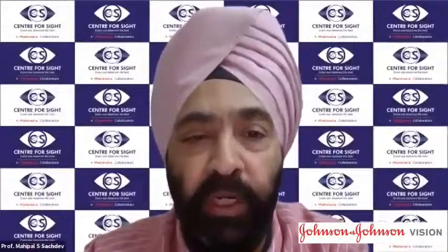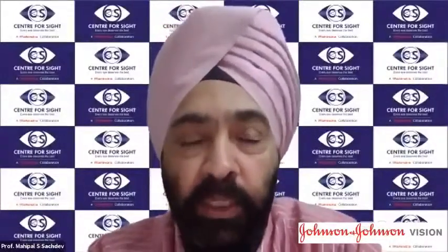Dr. Deepak, your point is well taken. The only thing I wish to say is that most of the new machines, the moment you switch on to the vitrectomy mode, will automatically bring down the bottle height. So the new machines have already taken care of that. But in case you have an older machine, obviously you have to do it. And I would 110% agree with what you have said, that the dynamics need to change when you're doing a vitrectomy over what they were when you're doing an I/A or a phaco. And I would just like to add, it's a very important part, that you need the highest cut rate you can possibly get.